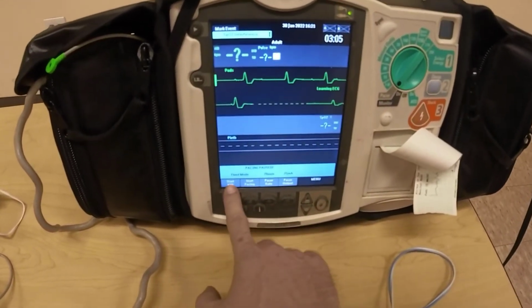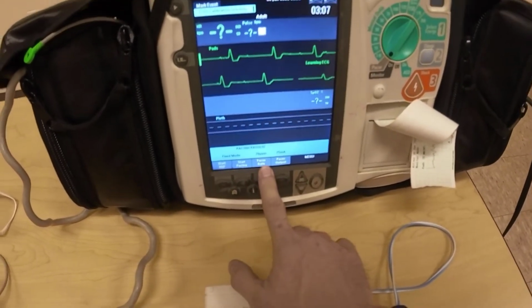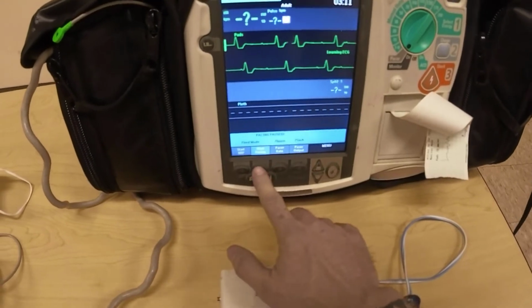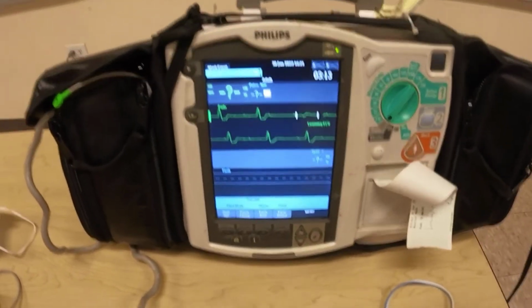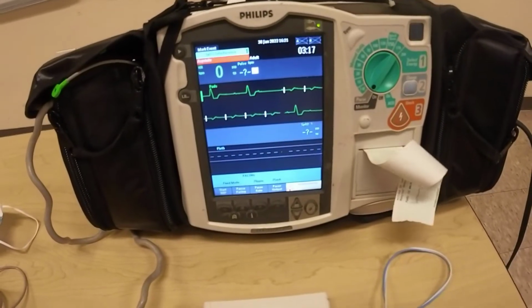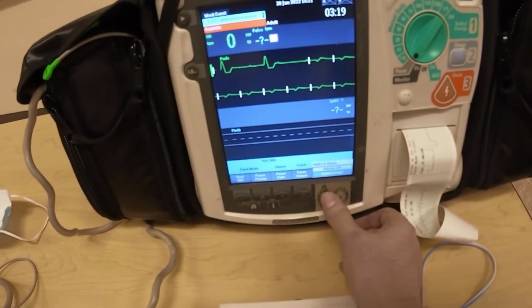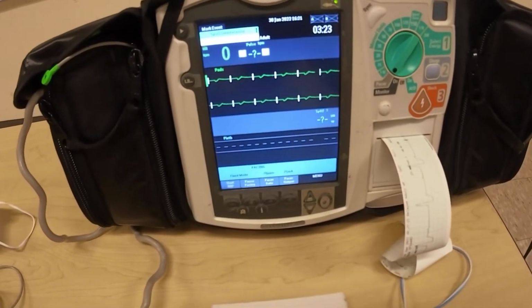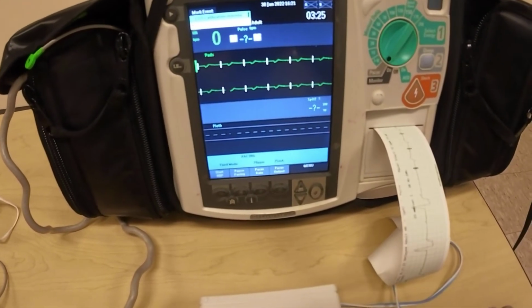Now we're in the fixed mode. Pacer rate is 70 and pacer output is 75 milliamps. I'm going to start pacing. And it doesn't quite look like it's capture, but it's in fact pacing, because the pacer spikes appear.